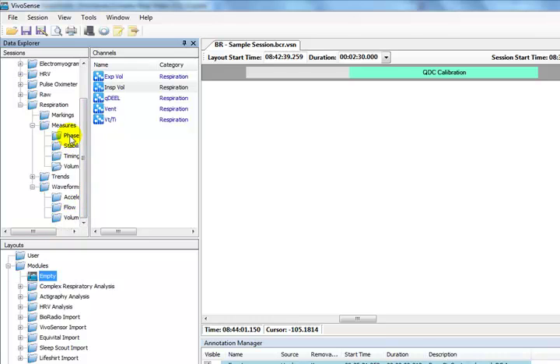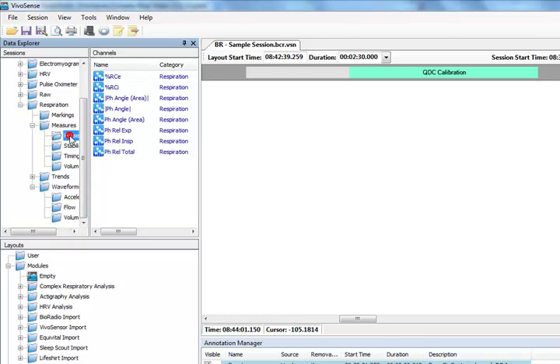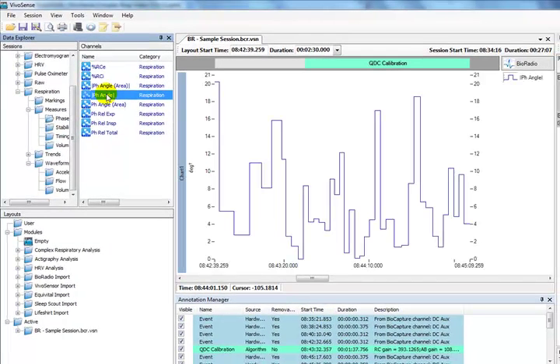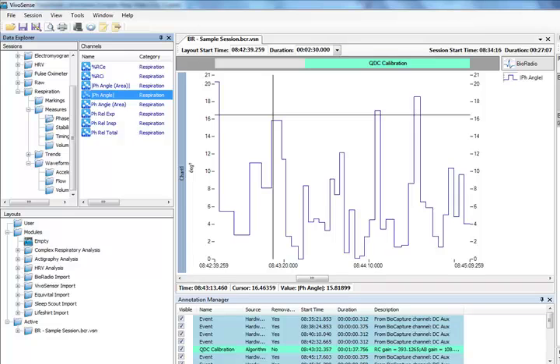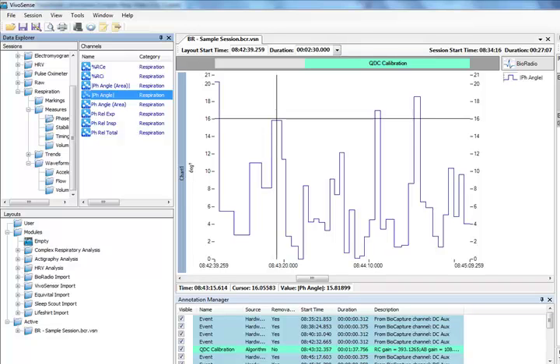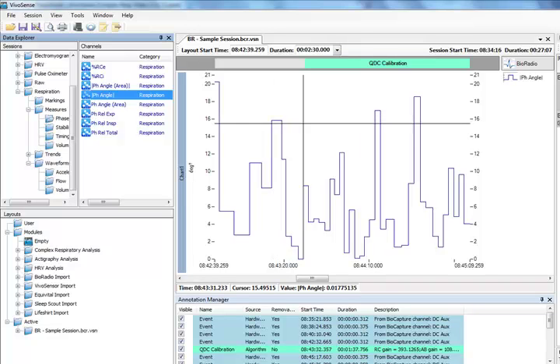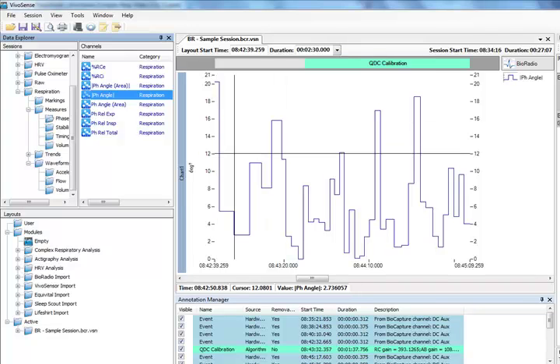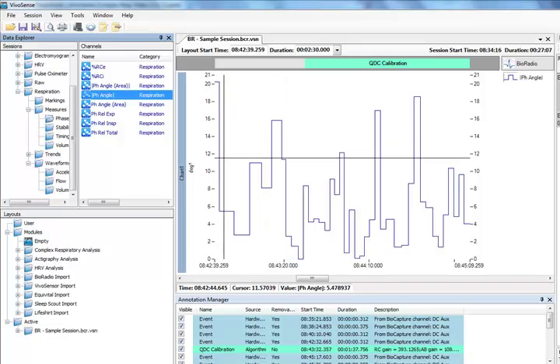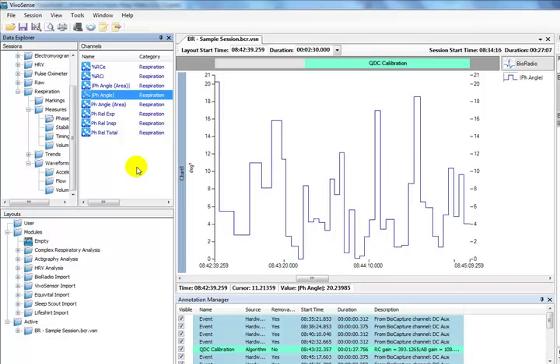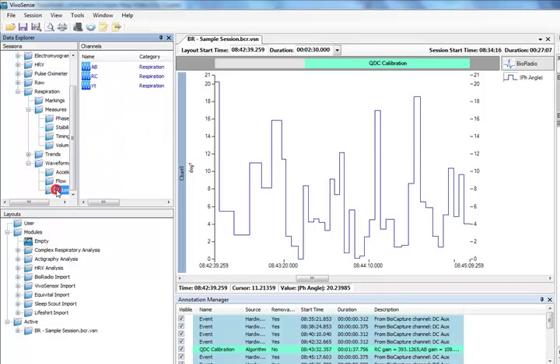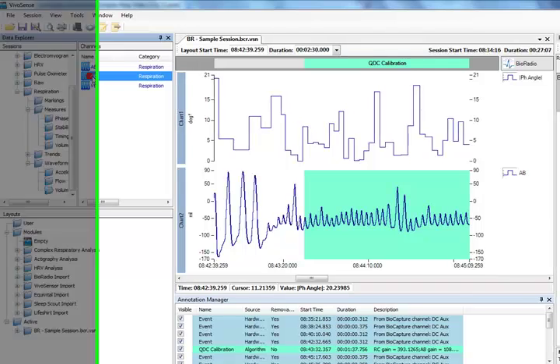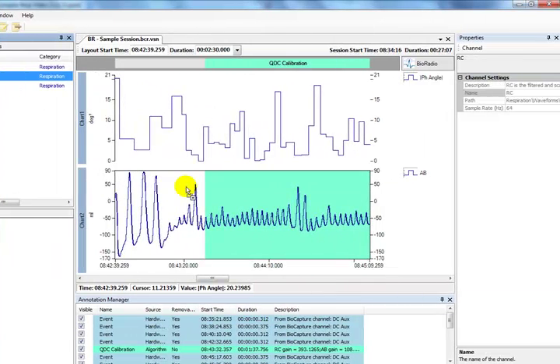One important measure in complex respiratory analysis is the phase angle. The phase angle shows how synchronized the ribcage and abdominal breathing compartments are. A phase angle of 0 degrees indicates perfect in-phase movement, while a value of 180 degrees indicates completely out of phase movement between the two compartments. To visualize the phase angle better, we can view the RC ribcage and AB abdominal waveform channels alongside the phase angle that we have just placed in the synchronized chart panel.